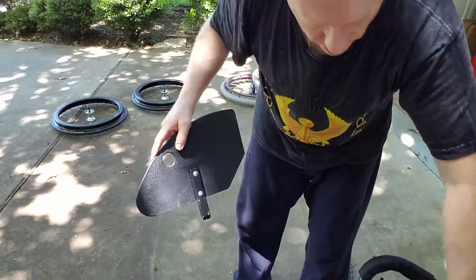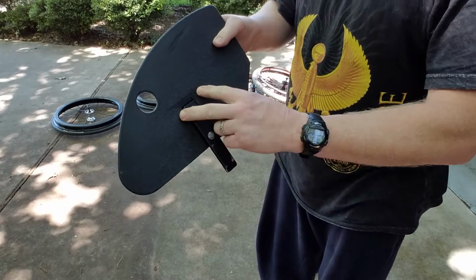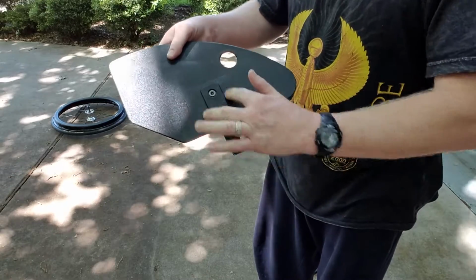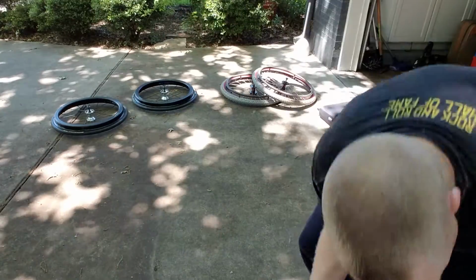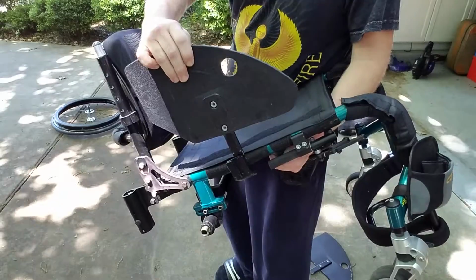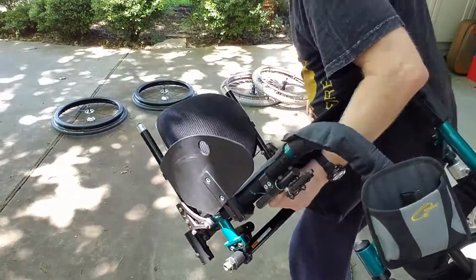you'll notice the piece is slightly different. One side is indented right here, and on the other side it goes out. This indented side faces in towards the cushion. So you just take this and it just slides in. It just slides in and out. Nothing locks it in place.